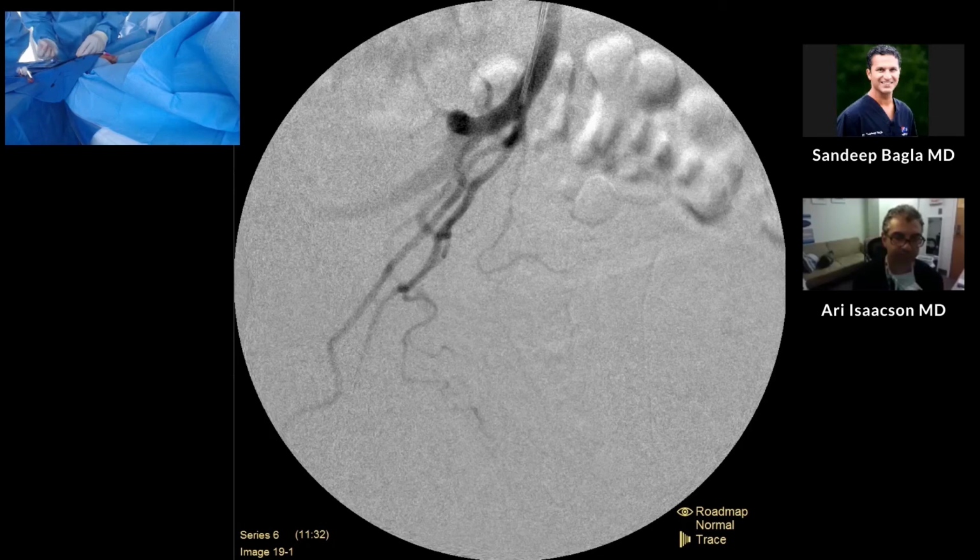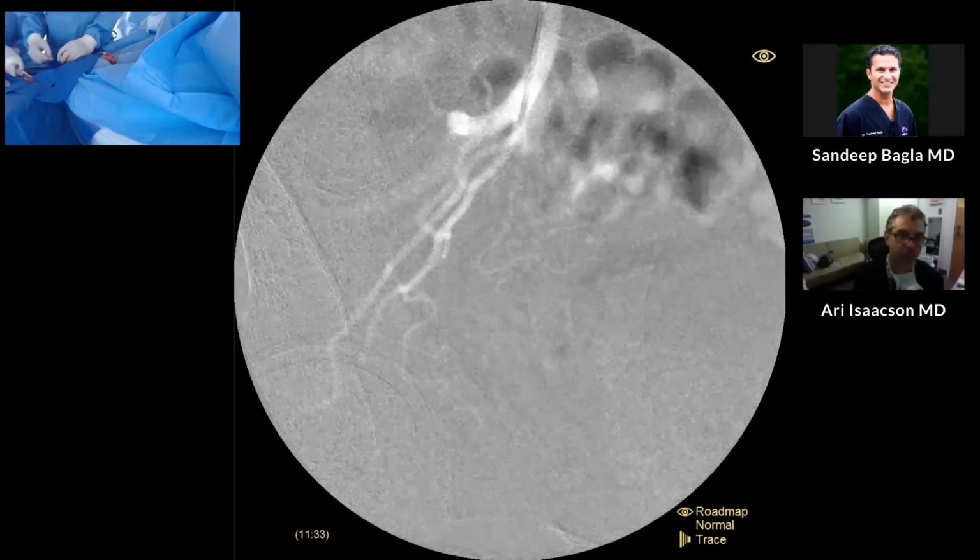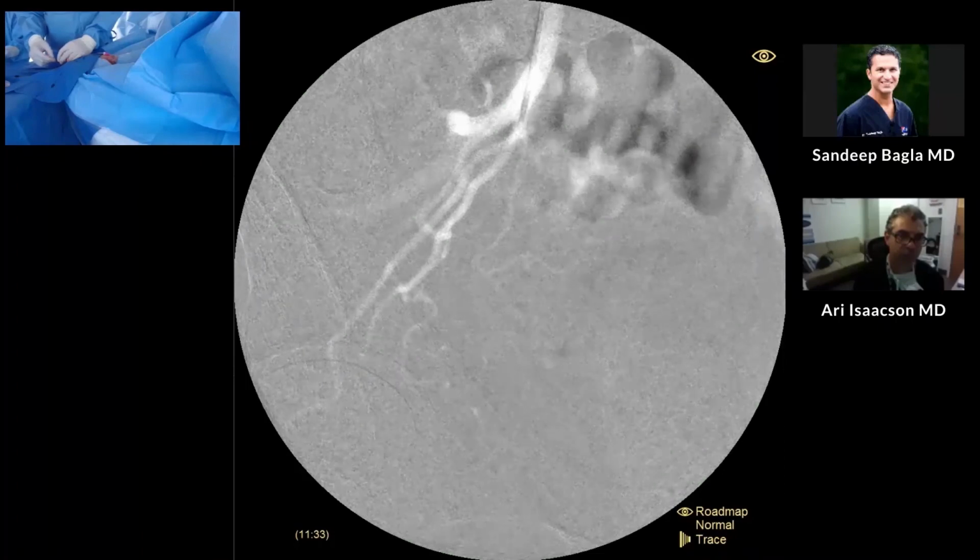Now, traded for some, obviously, maybe increased postoperative symptoms in terms of urinary frequency or dysuria. But overall, I'm very happy with the clinical results. And I think everyone tracks their own clinical practice and really has to figure out what's working for them. But in the absence of seeing collaterals that I'm worried about, I will start with that 100 micron size.